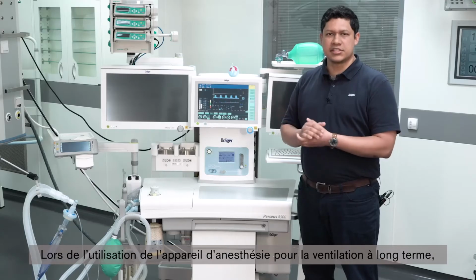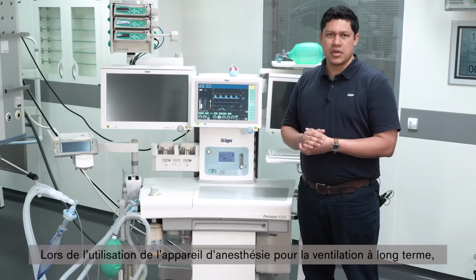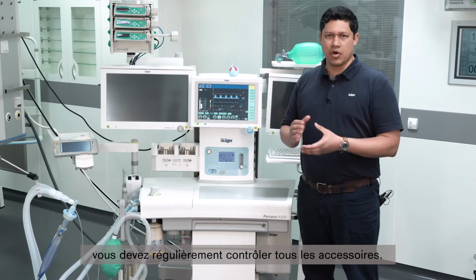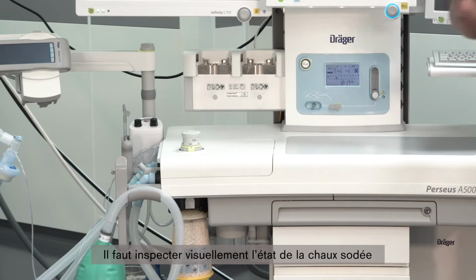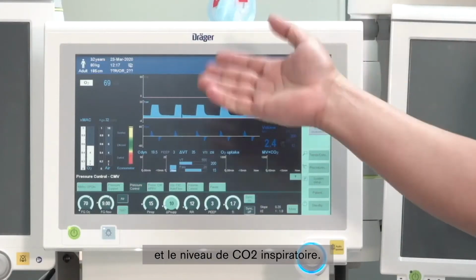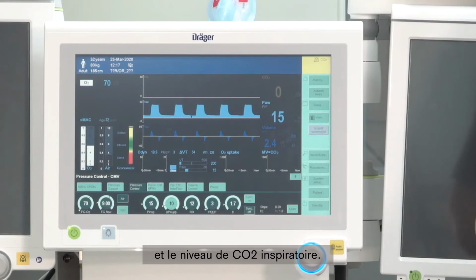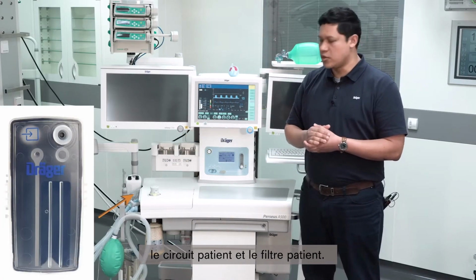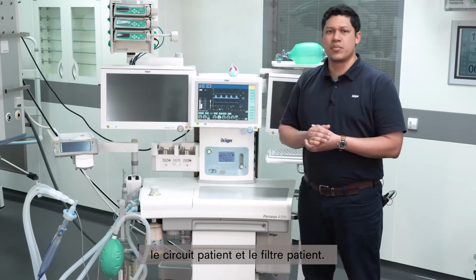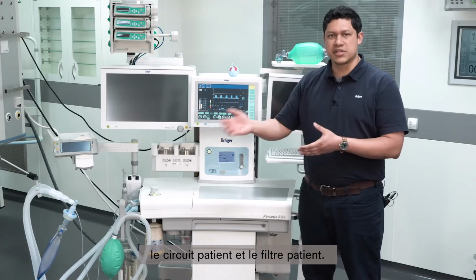When using the anesthesia device for long-term ventilation, you have to regularly check on all the accessories on it. You will have to visually inspect the condition of the soda lime and also the inspiratory level of CO2. You have to check on the gas measurement water trap. You have to check on the breathing hose system and the patient filter.